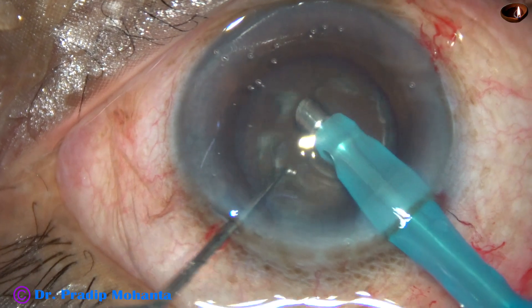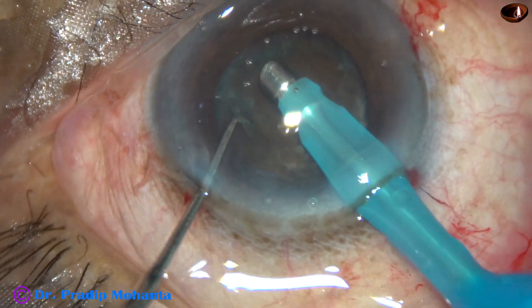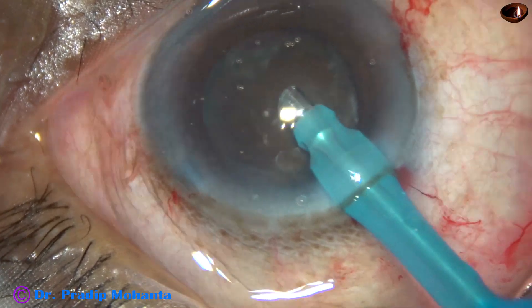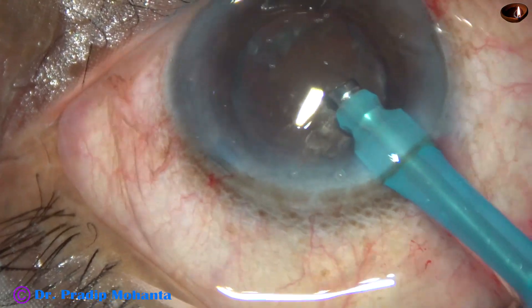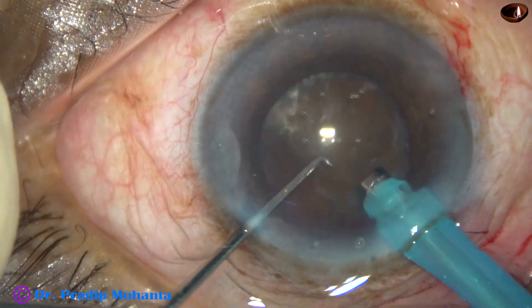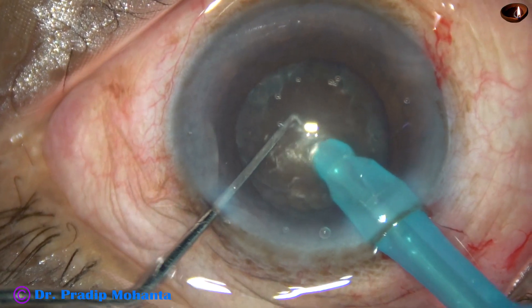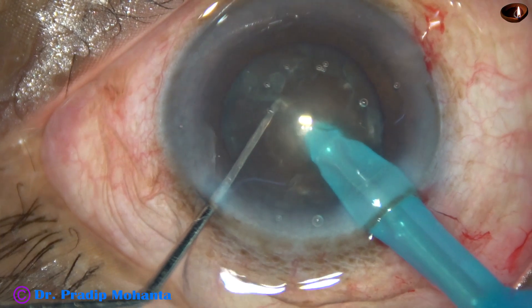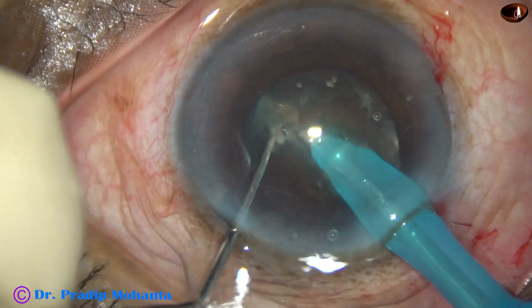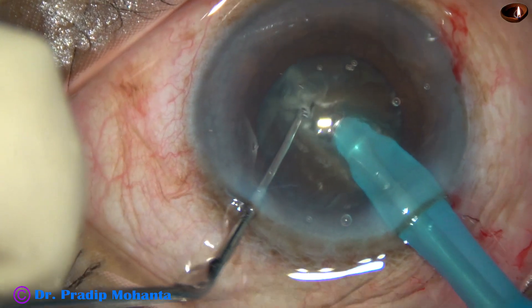The tip goes beveled down. Some superficial cortical lens matter is removed — about 0.5 mm thickness of the lens is removed. The nucleus is pushed a little down, and the tip goes into the substance of the nucleus just in front of the main incision. It goes through the substance of the nucleus like a submarine, towards the opposite side of the nucleus. After it crosses the central hard core, the chopper is used to divide the nucleus.